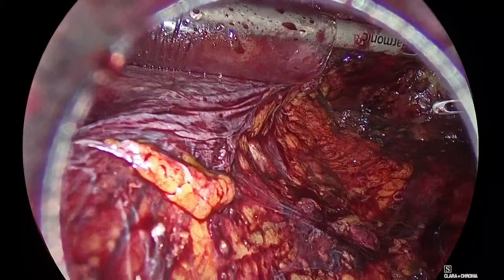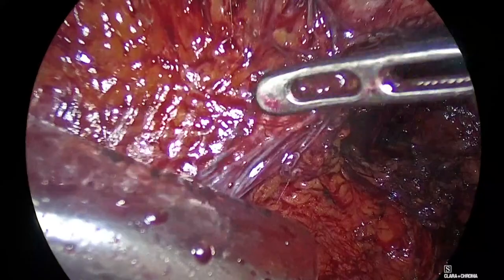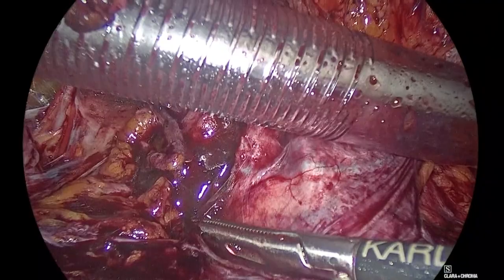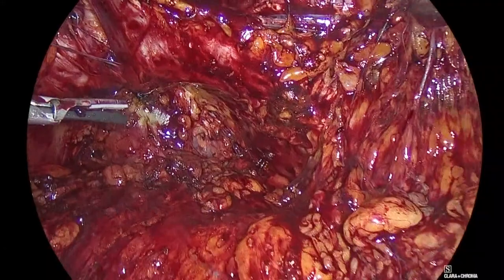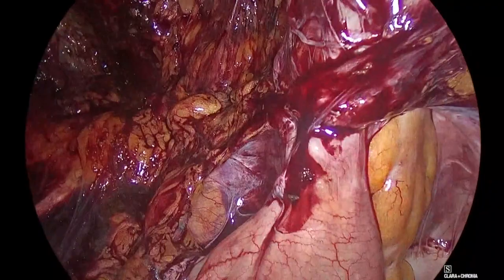Here you can see the mesh. Look at the mesh sutures here. You can see it here. Everything was hard rock, so I needed to go further up, and you see the muscle there, bypassing the hernia mesh. I have some friction here, and there's some resistance here, but it's okay. Then on the right side, again, everything was stuck, so I created a space, and look at the very interesting thing here. The bowel comes all the way up.